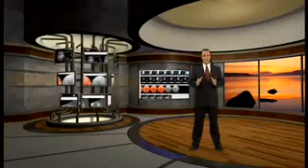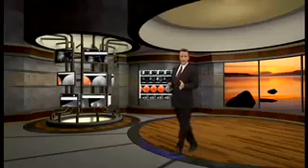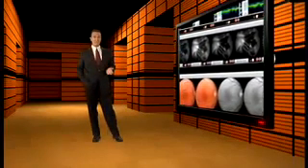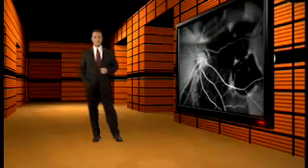As Dr. Ulansky illustrated, the iRoute image management system proved very useful in helping with patient flow, improving efficiency, reducing time in finding and refiling clinical photos, and creating new charts, all of which translate to cost savings. Patients benefit too, because iRoute provides easy access to patient information, including ultrasound, OCTs, and clinical photos in one quick search. Patients can immediately see results as you explain a condition, such as a macular hole.